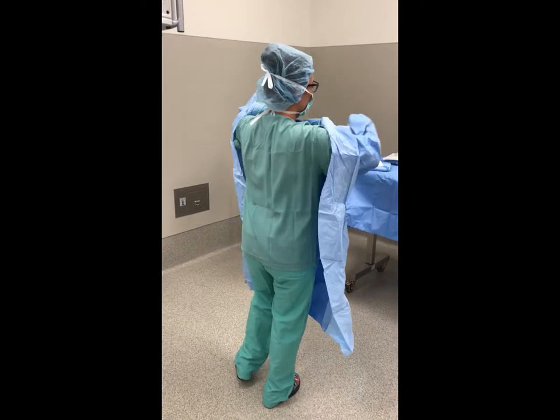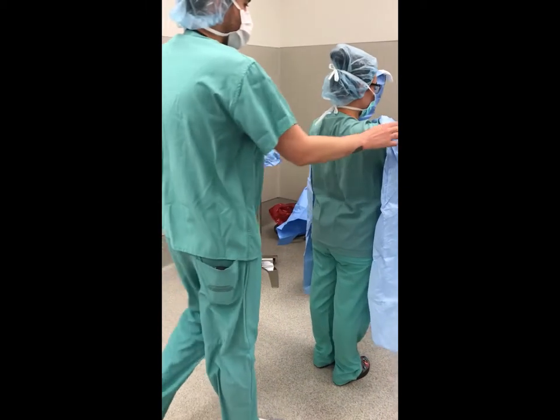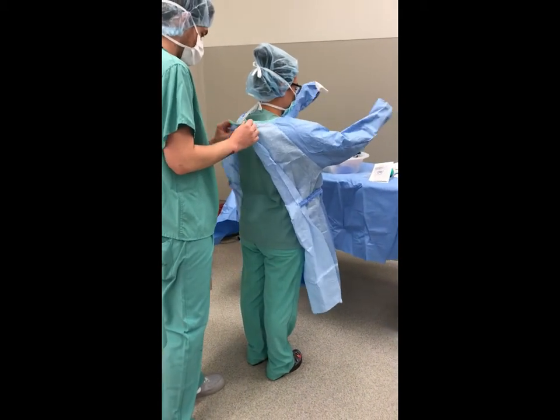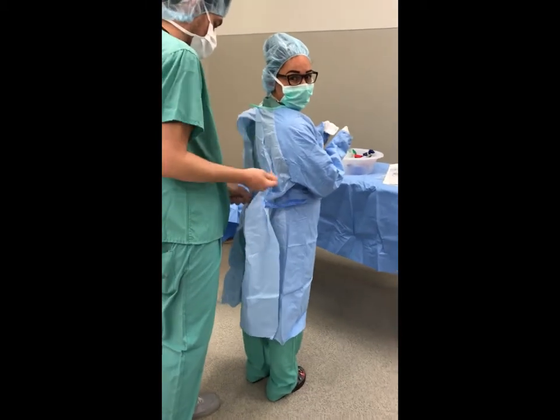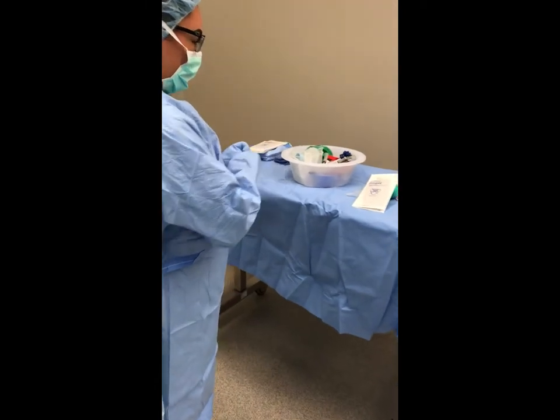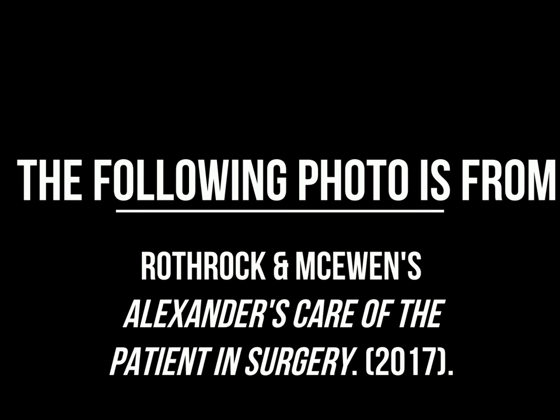Slide both hands into the open arm holes, keeping the hands at shoulder level and away from the body. Push the hands and forearms into the sleeves of the gown, advancing the hands only to the proximal edge of the cuff. The circulating nurse will pull the gown over the scrub person's shoulders, touching only the inner shoulder and side seams, and will secure the neckline and tie the waist, touching only the inner aspect. The neck and back of the gown should be completely fastened by the circulating nurse before the scrub person dons gloves, to prevent contamination from flapping of the gown.